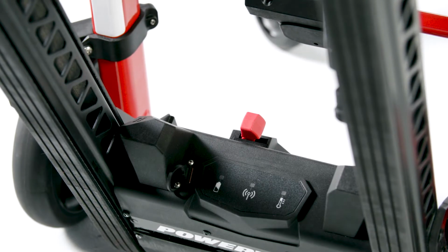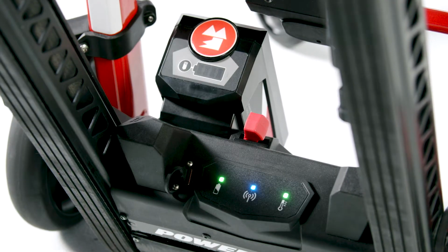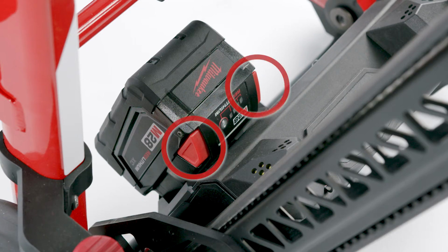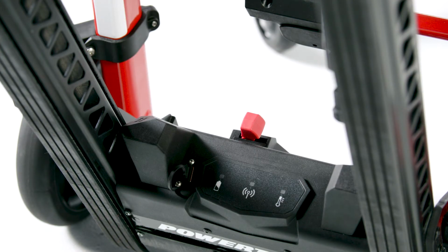To attach the battery to the PowerTraxx, slide the battery onto the mating guides on the power unit until it locks into position. To remove the battery, press the red release button next to the EnduraCharge battery, or depress the red release buttons on the side of the Milwaukee battery. Then, slide the battery up and off the guides on the power unit.